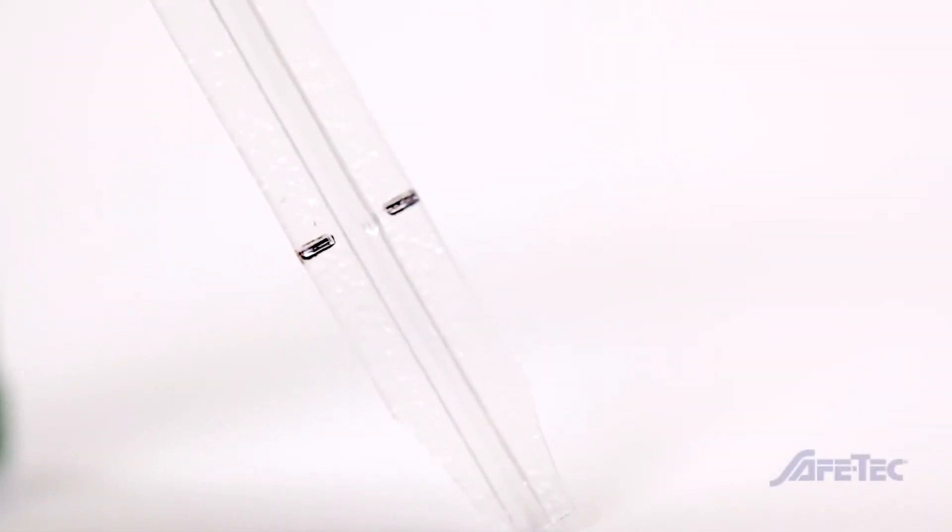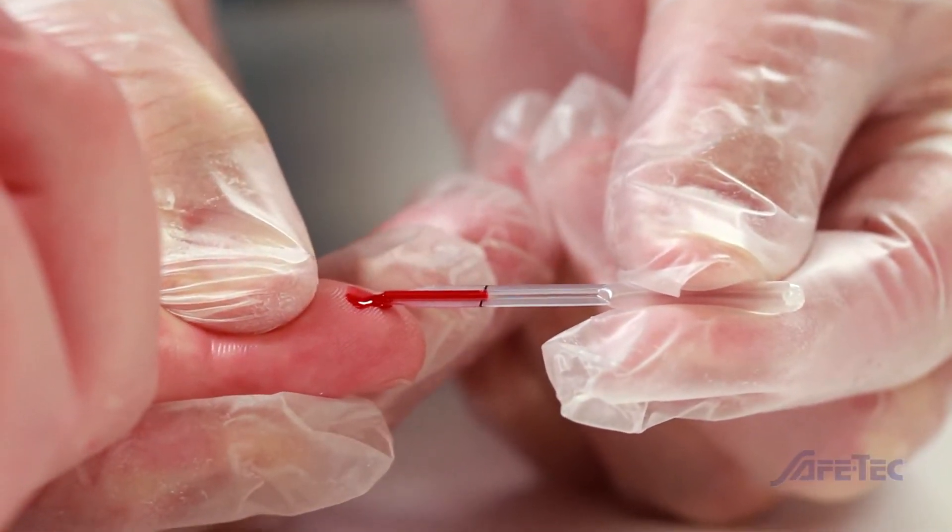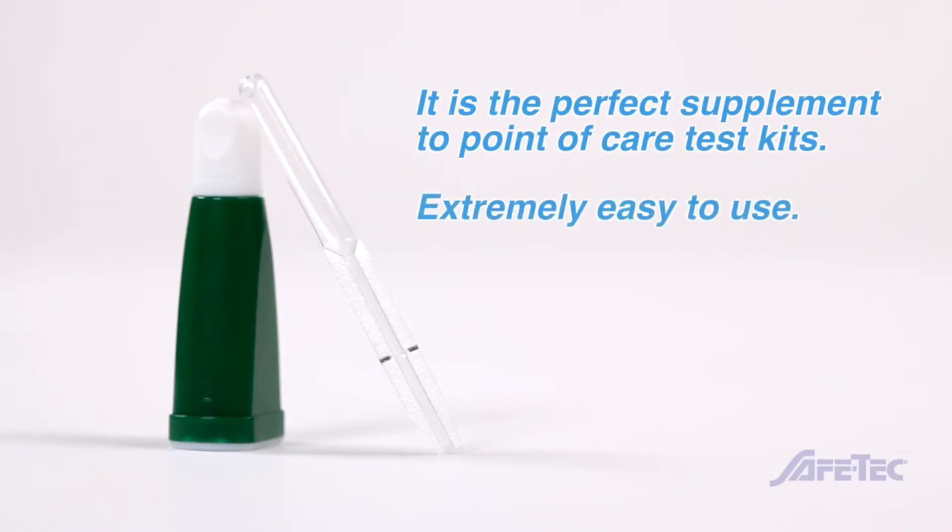Microsafe is a one-piece plastic tube used to collect and dispense microsamples of whole blood from a finger stick. It is the perfect supplement to point-of-care test kits and is extremely easy to use.